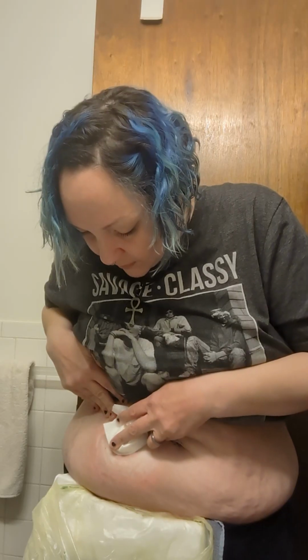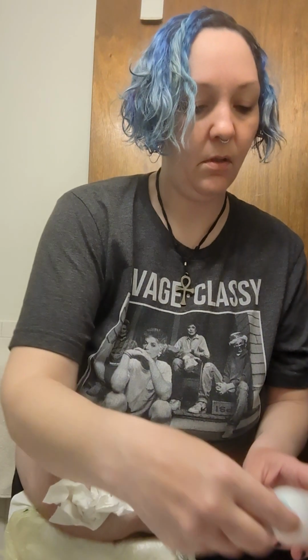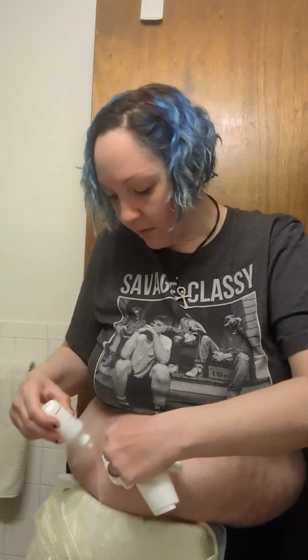Alright, so now is inspect the skin. My skin looks irritated still, but not angry. So we're going to use stoma powder from Brava, which absorbs moisture and helps the area. I don't know exactly how. The funny thing is you literally put it on to take it off.